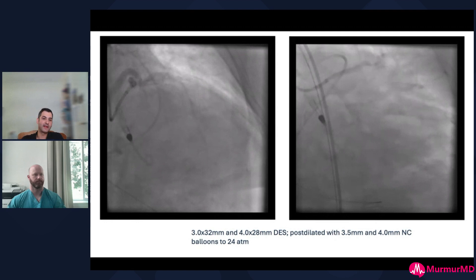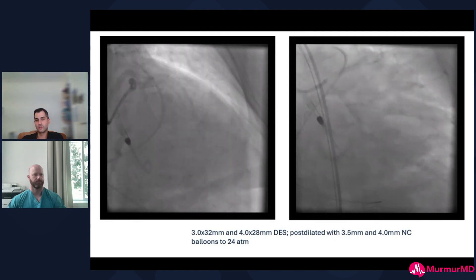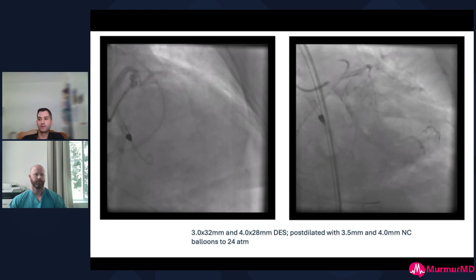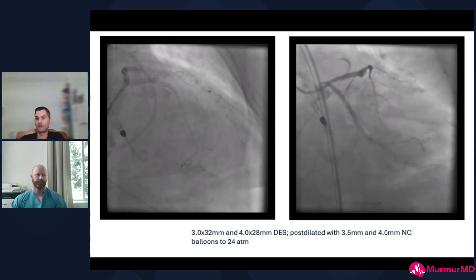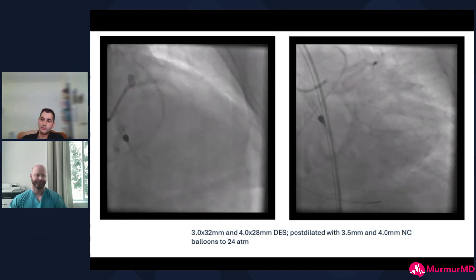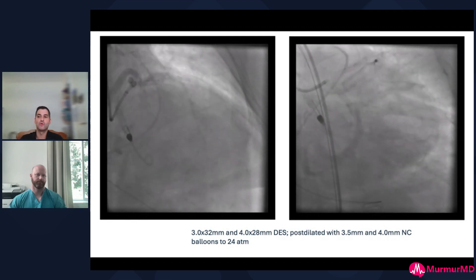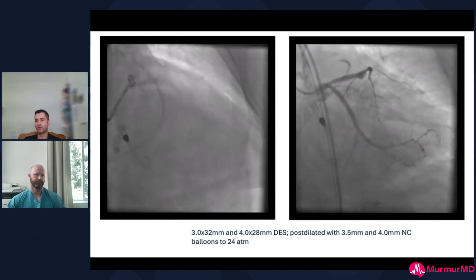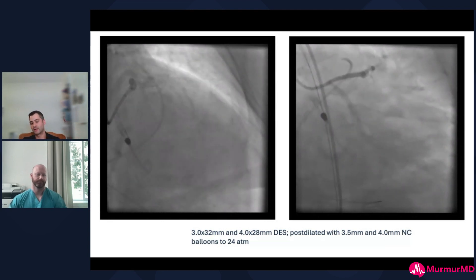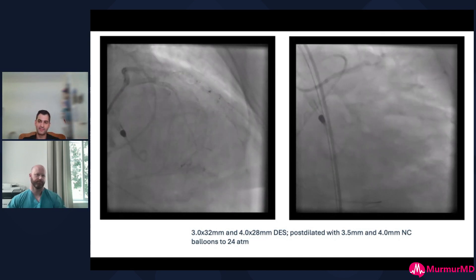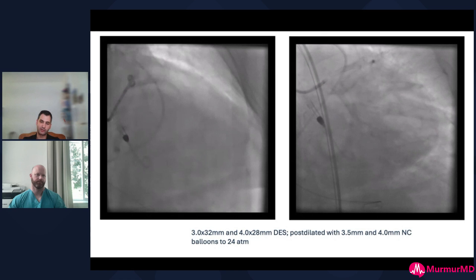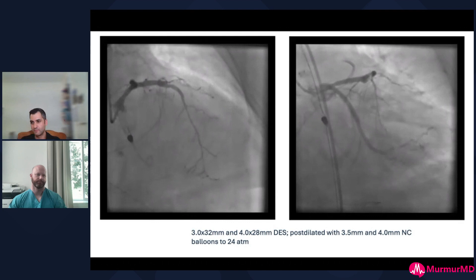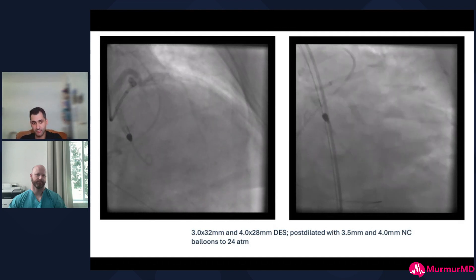After the workhorse wire, I add a microcatheter, then go to hydrophilic but non-jacketed wires like a regular Sion, then go to jacketed wires like a Sion Black. That's a hierarchy of safety — I only want to use tools with more predilection for complications when I really need them. Jacketed wires are more likely to dissect; high-gram tip wires more likely to perforate. I try and keep everything as safe as possible. The Sion Black is an outstanding wire for this type of lesion and complexity.